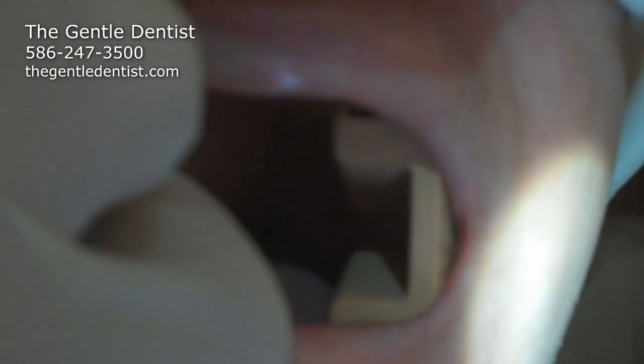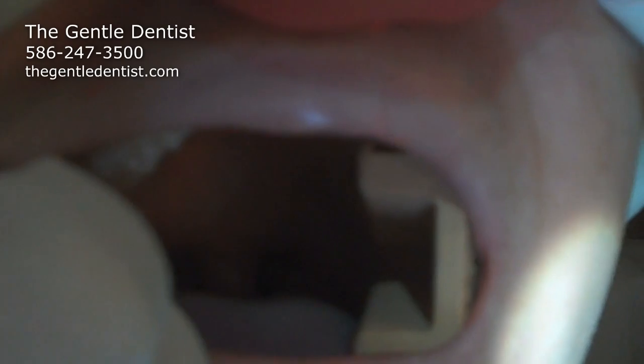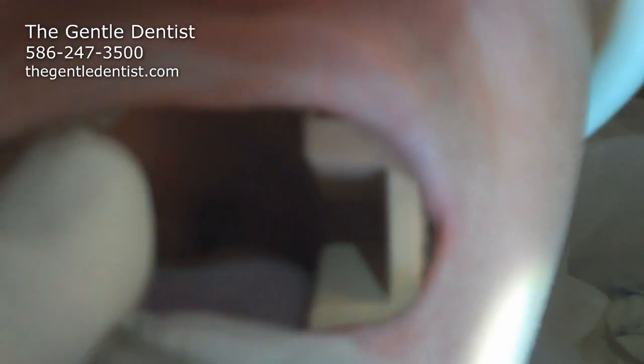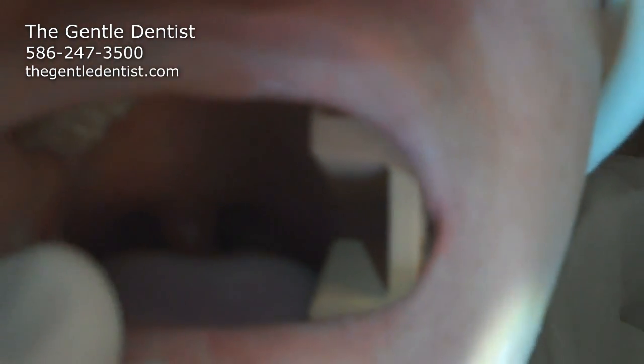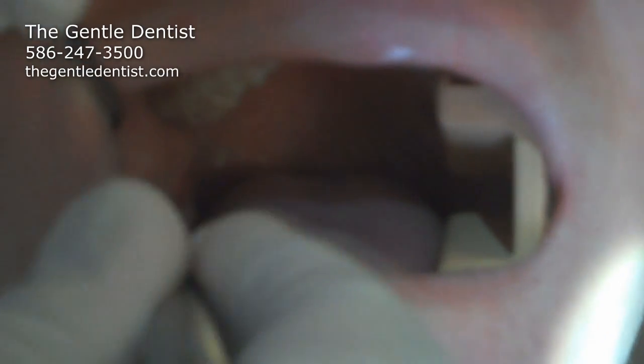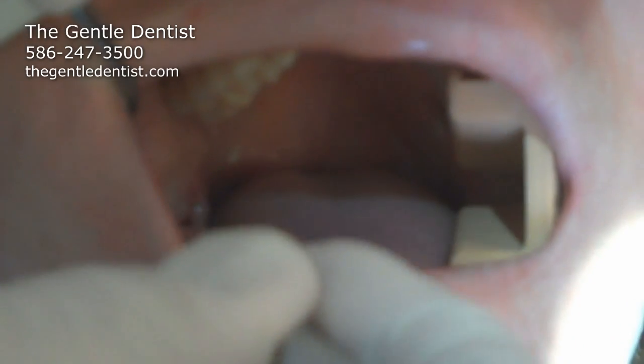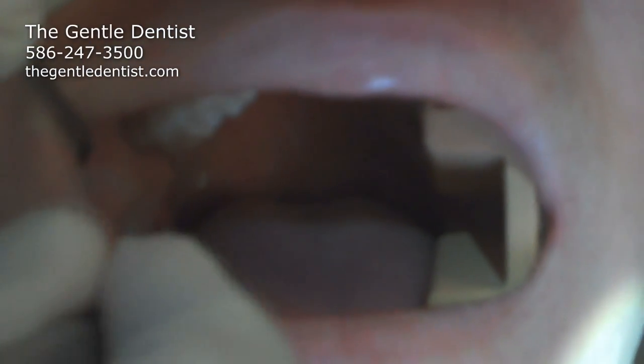I'll need a periosteal elevator. Okay. Now, Marshall, you're just going to feel some pressure, okay? And you're not feeling anything, correct? Okay, good. You're just going to feel lots of pressure now, okay? And now I'm just going to go ahead, and you get to see this on YouTube. Just think, isn't that fun?